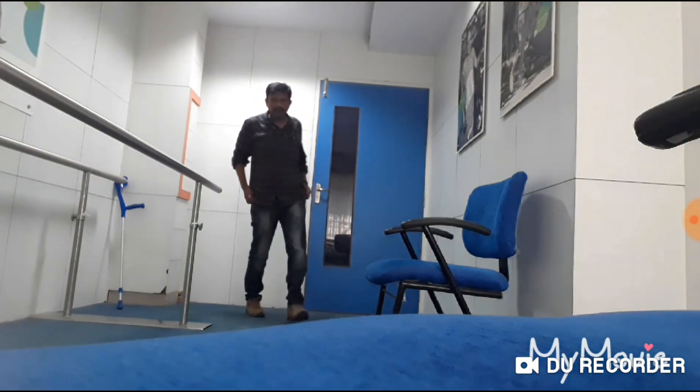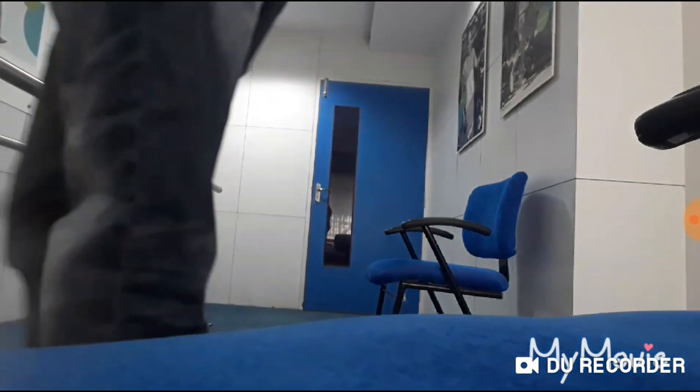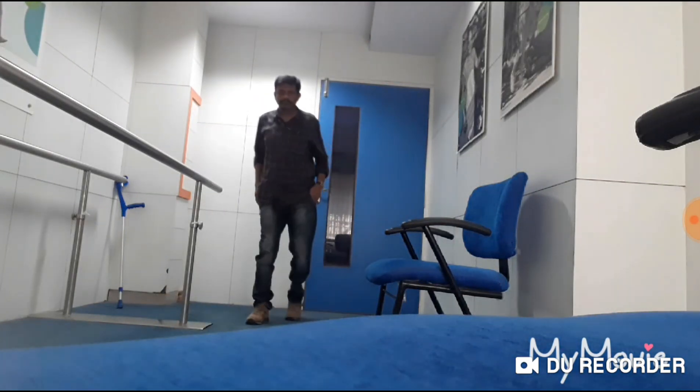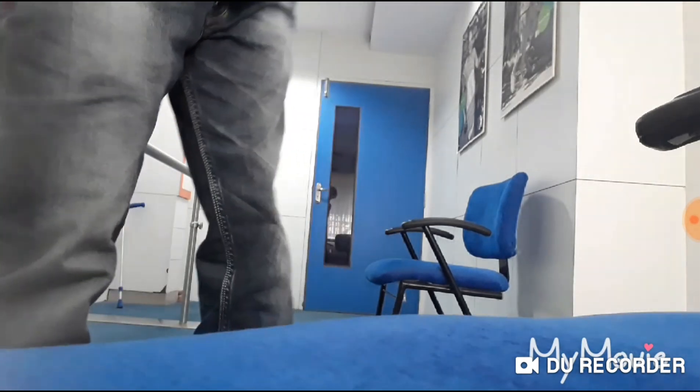Now you can see that the knee joint is completely free and I am able to walk the way I was walking previously when the knee joint was working perfectly. You can see the noticeable changes in the walking pattern — when the C-Leg was discharged versus now when it is in the charging condition.